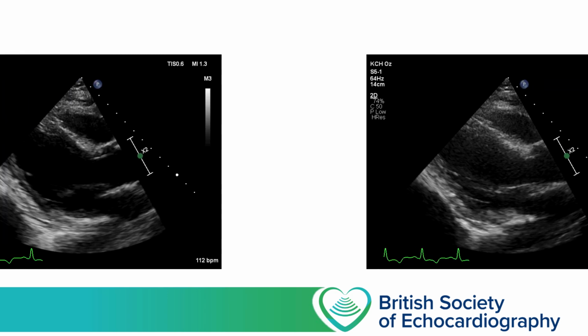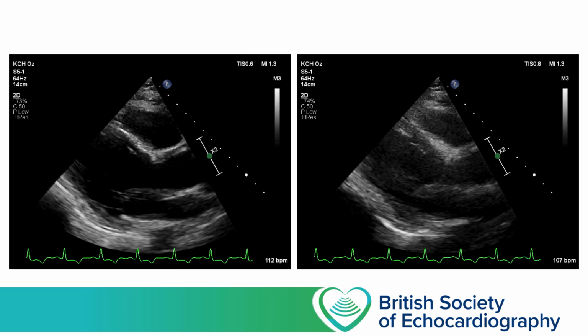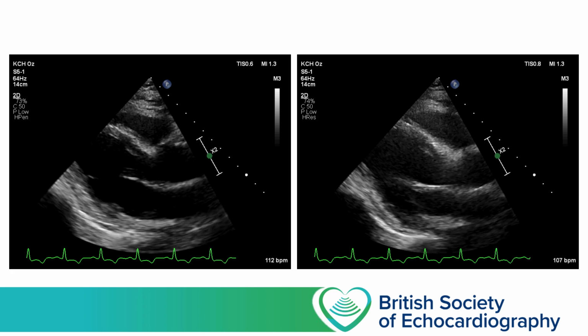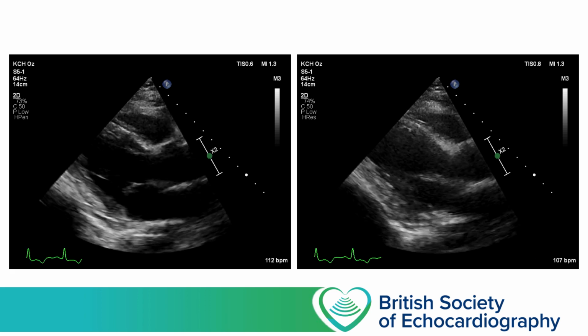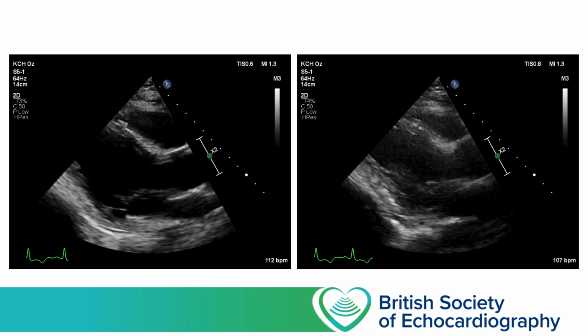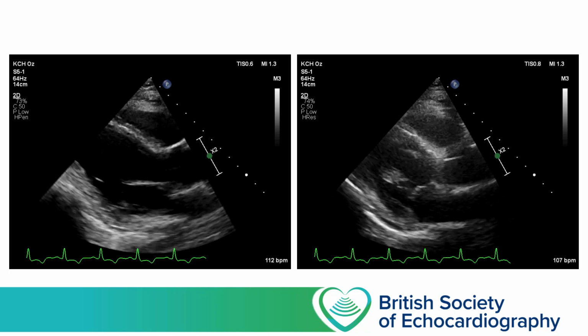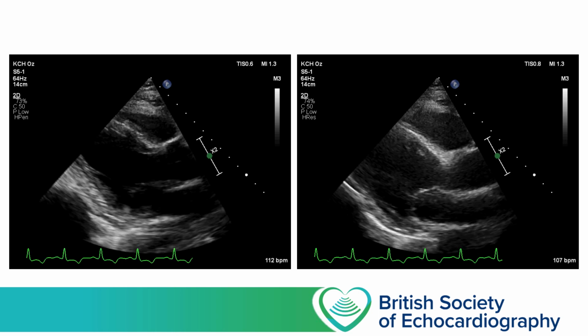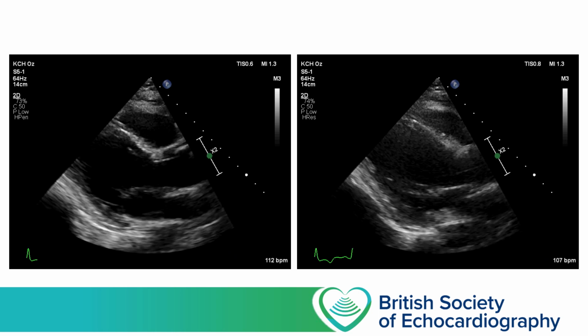In addition, the ultrasound software may allow you to adjust the frequency of a transmitted wave. So here we've got two images, both with the same sector size and the same line density, but the image on the left has been produced using a low frequency ultrasound wave that favours penetration, whereas the image on the right has been generated using a high frequency wave, which favours resolution in the near field, but suffers when trying to image the far field.